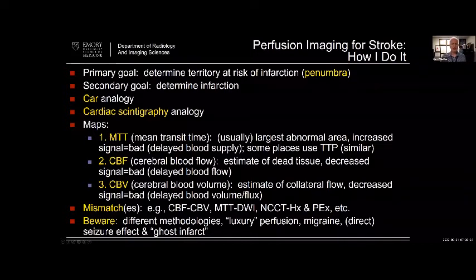Anyway, you could have other kinds of mismatches. For example, the physical exam. Clinically, maybe a patient clearly has had a stroke. You do the non-contrast head CT and it looks normal. Maybe it's normal, you know, so that is a form of mismatch. Another thing people will focus on is maybe perfusion versus DWI. There's a lot of different mismatches. You've got to ask them what they mean by that. And for the sake of focusing on trying to be useful around CTA, I'm not going to jump into that. I will mention in passing a few things.